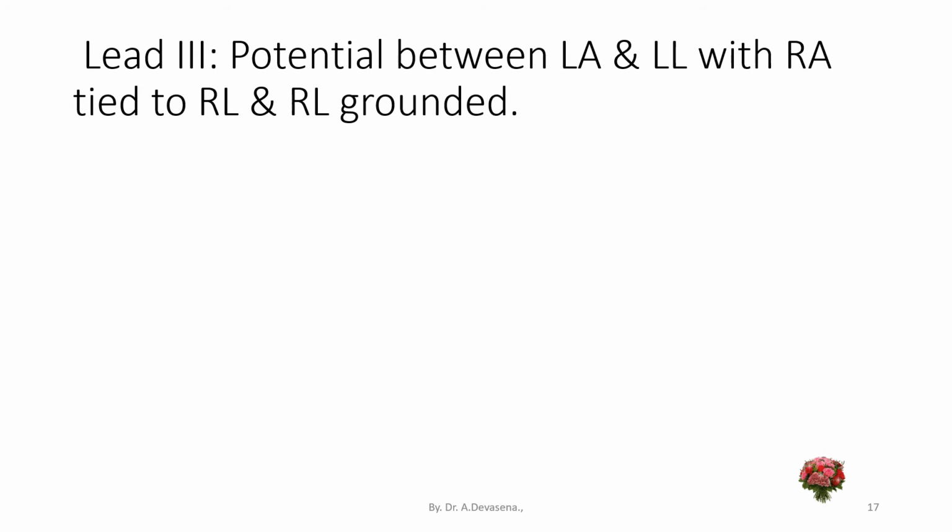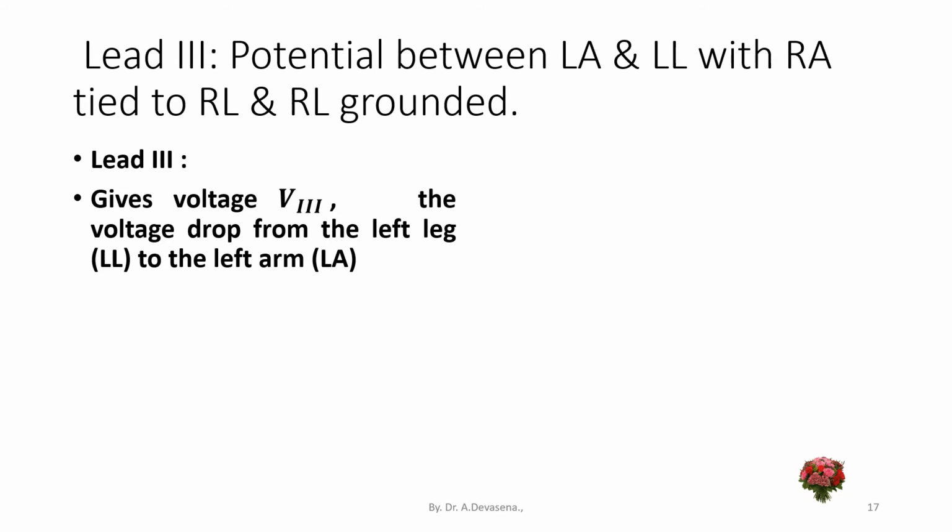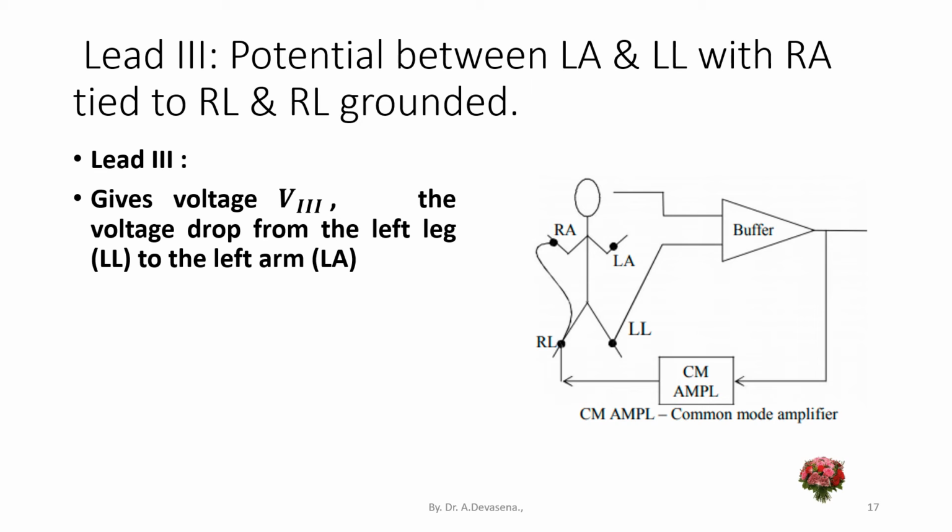Lead 3. Lead 3 gives the voltage V3. The voltage drop from the left leg to the left arm. This is the representation of lead 3.